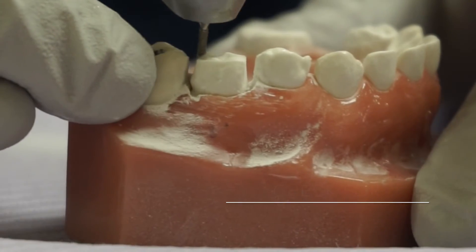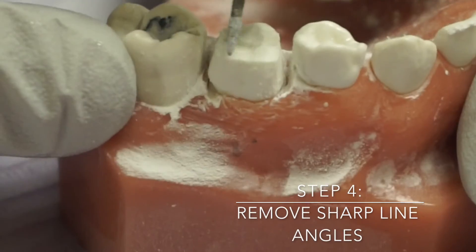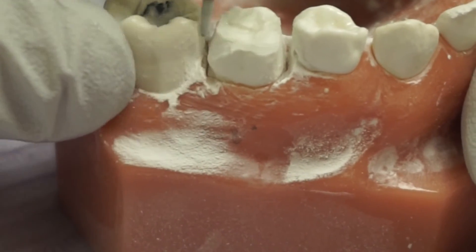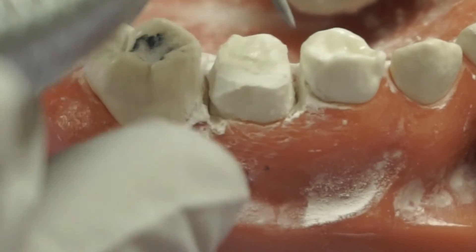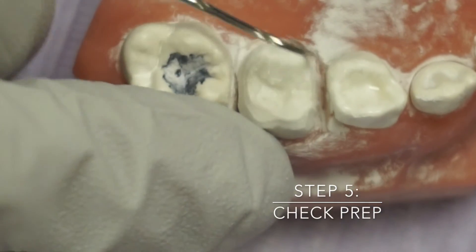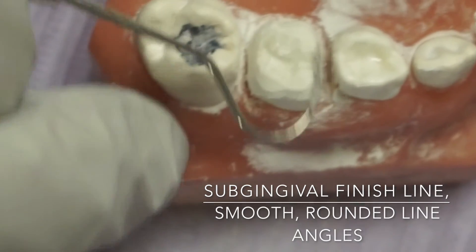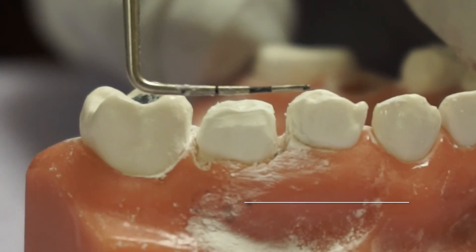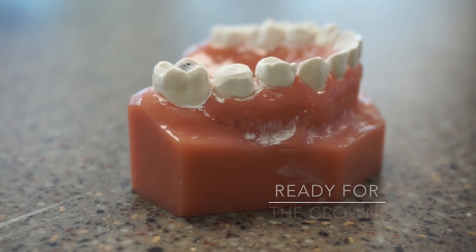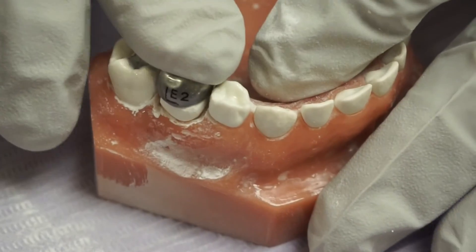You should have feather edge finishings. Now I created line angles here. The prep usually goes subgingival and it should be smooth. All line angles are rounded off, and there's still some anatomy — from lingual to buccal.